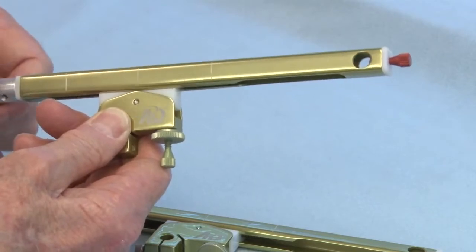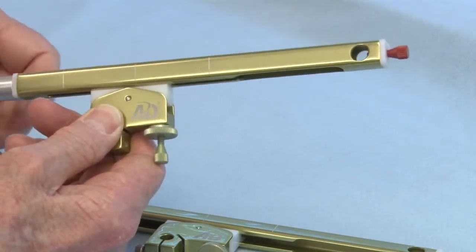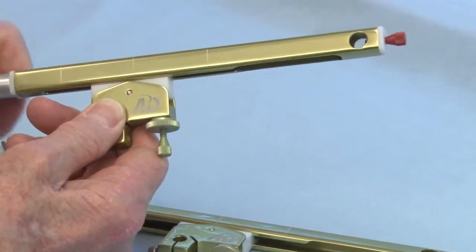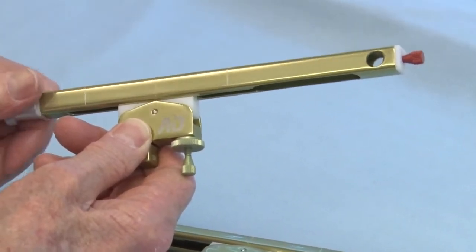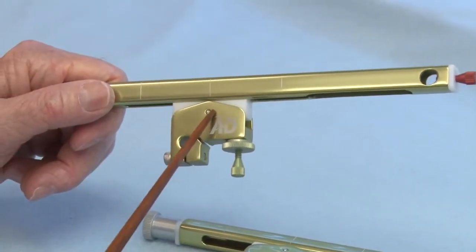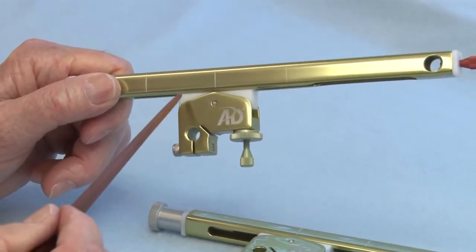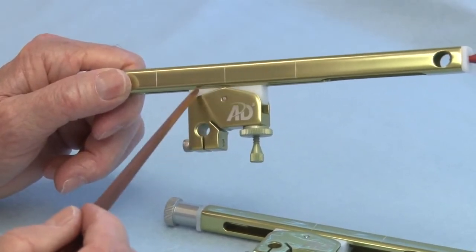so for a big patient, I have to move the side arm like this. And so this determines the location of the stylus pen on the patient. When I start with the patient, I like to start with it centered on the middle mark here. The next thing is, if you look at the two white plastic pieces here, I want to see equal amounts of the white plastic when I place it on the patient.